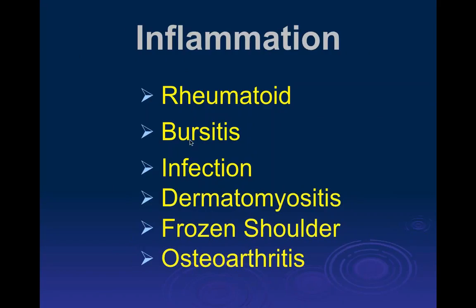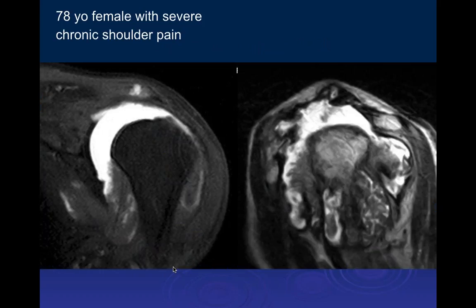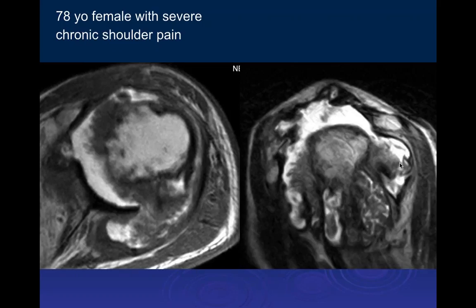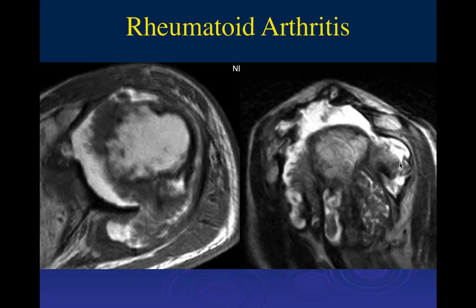Now let's discuss inflammatory disease of the shoulder — rheumatoid arthritis, bursitis, infection, and other inflammatory conditions. In this 78-year-old female with severe chronic shoulder pain, the coronal PD fat-sat arthrogram and sagittal image show marked synovial thickening in the axillary pouch and subacromial region, with contrast communicating freely into the subacromial-subdeltoid bursa, indicating a full-thickness rotator cuff tear.